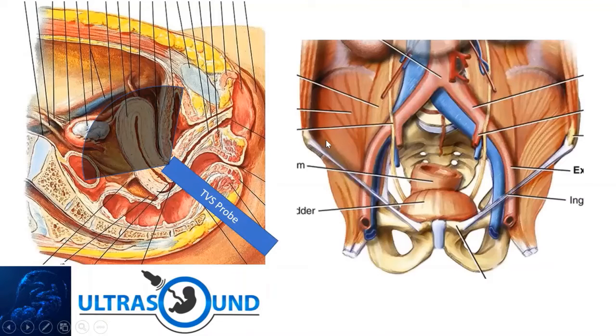All right. So this is a coronal view. As you can see, this is your ovarian fossa. You can see the iliac vessels over here. This is the external iliac and this is the internal iliac. So the ovary just overlies on top of it. When you put your probe at the center, you actually need to shift your hand. This is the uterus. You need to shift your hand to the patient's left for you to be able to see the patient's right ovary.